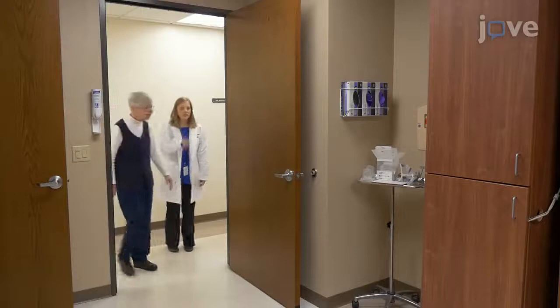Begin by escorting the participant into the setup room. Instruct the participant about the home sleep test device, or HST.